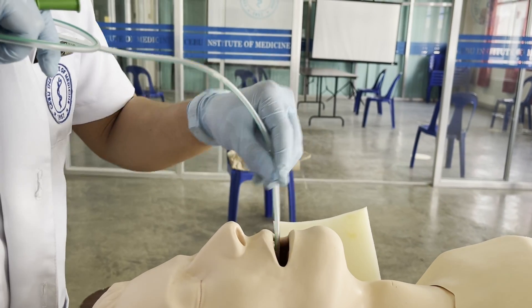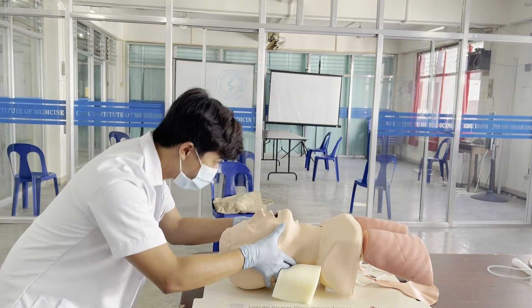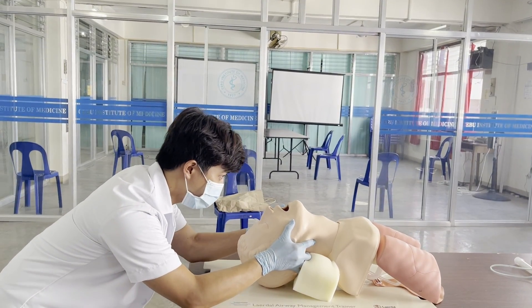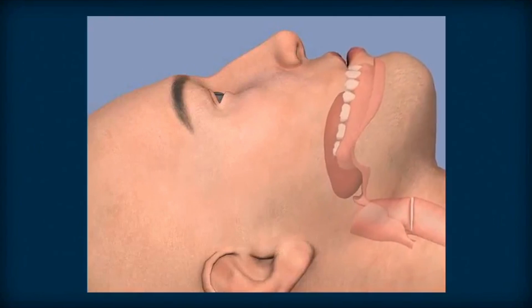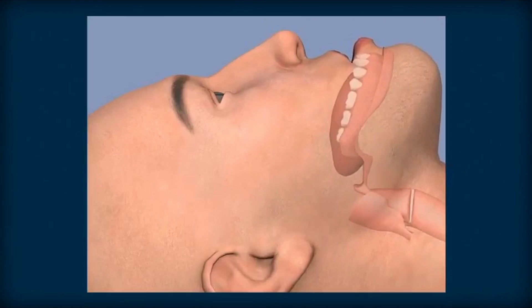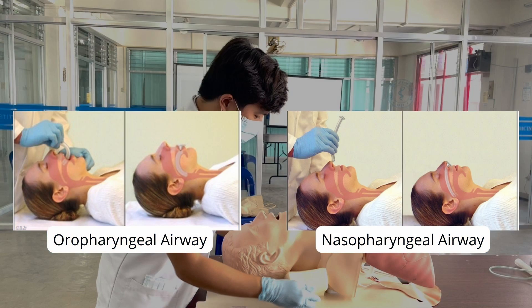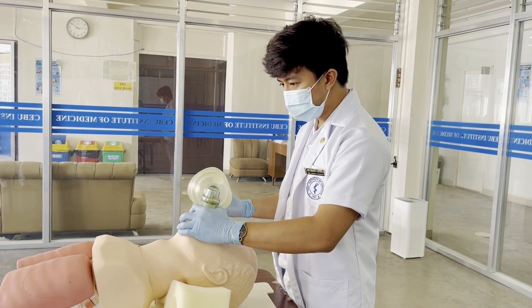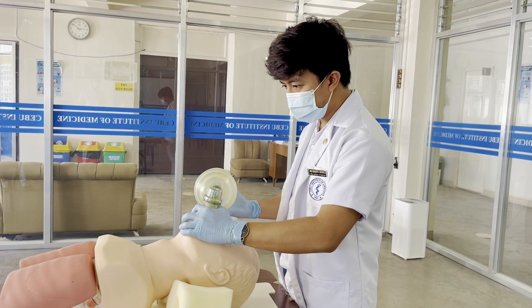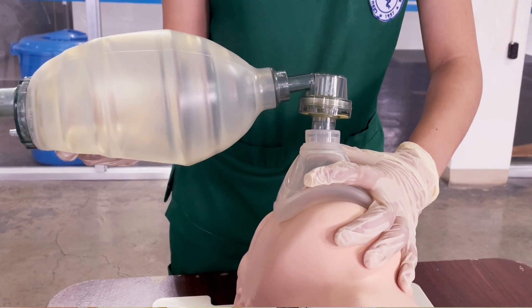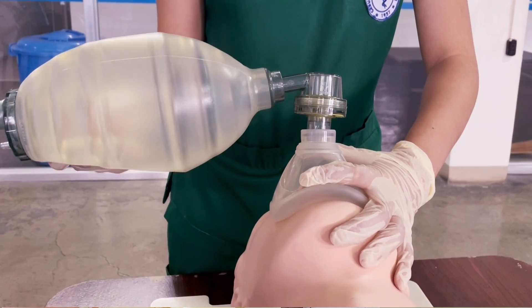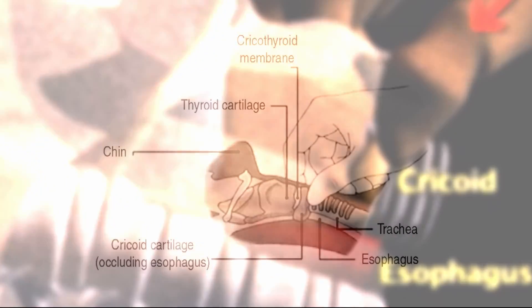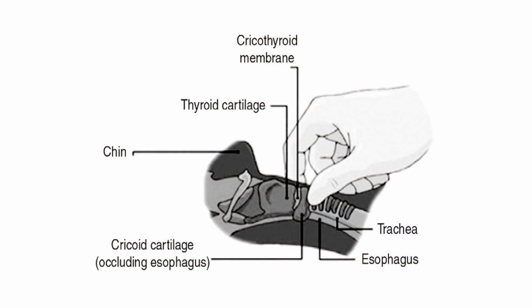Suction secretions that may cause airway obstruction. Then perform the jaw thrust maneuver by moving the tongue anteriorly with the mandible, minimizing the tongue's ability to obstruct the airway. To maintain the airway, an oropharyngeal airway can be inserted through the mouth or a nasopharyngeal airway through the nose. A few minutes of pre-oxygenation is started prior to intubation whenever possible. Hold the mask with good grip to ensure an airtight seal. The Sellick maneuver is performed to help align the airway structures and reduce the risk of regurgitation.